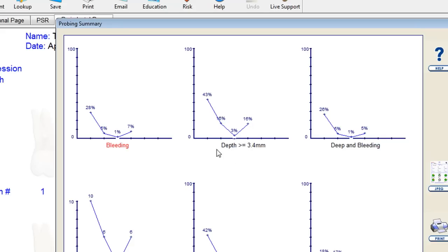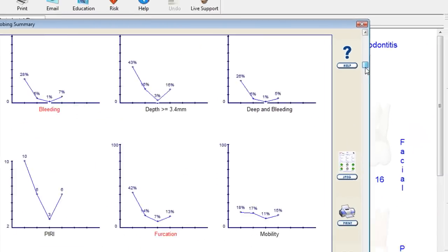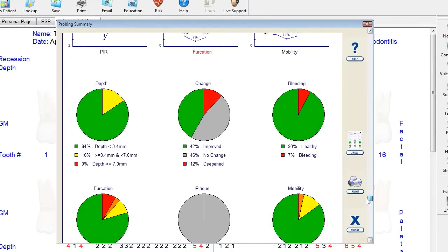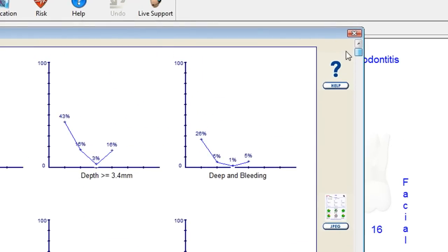The sites we consider at a warning level are anything past 3.4 millimeters — you can adjust this to any level you feel is appropriate. We're noticing a trend from 3% to 16% of sites having gained some swelling or worsening pocket depth. The deep sites are also the ones that are bleeding in most cases. For other summary information, you can see additional data as well as pie charts per visit and graphs for up to six visits. You can email or print any of these charts.